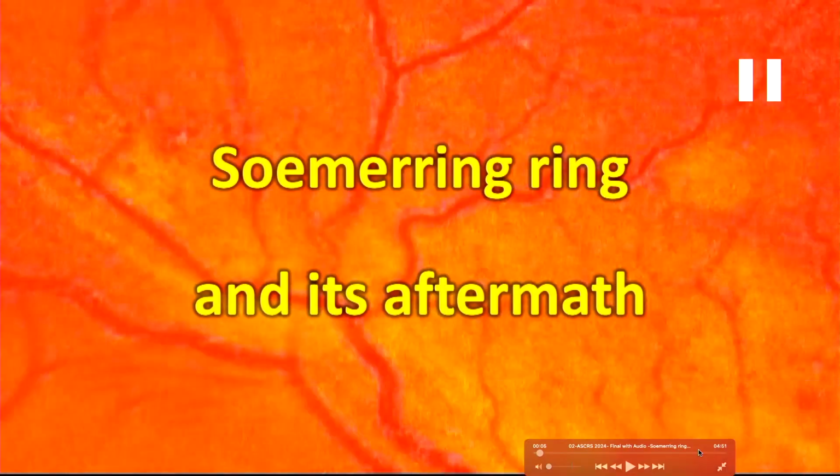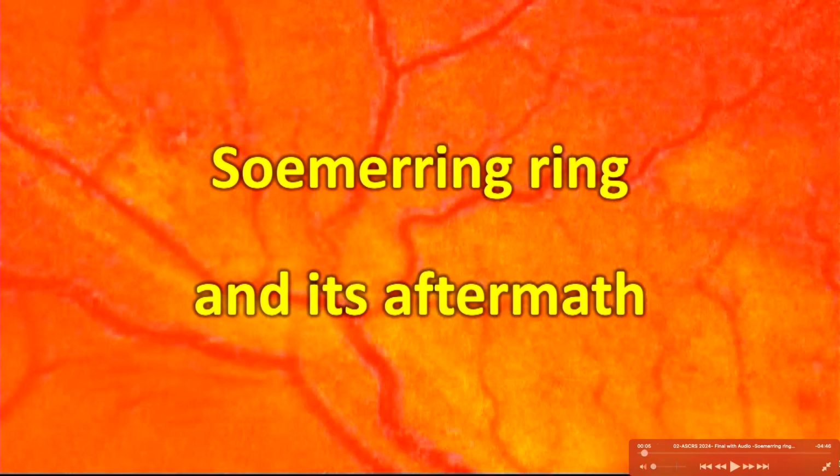But we don't know the reason. Though I did a meticulous polishing, in the other eye there was no displacement. So was it something to do with thalassemia major, where the oxygen supply or the capsule may be weak? We have no idea. So she still may need to get a glued IOL after all.